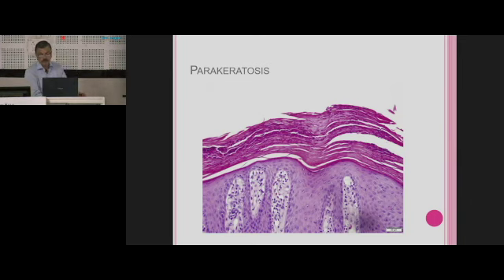The presence of a normal basket weave pattern above indicates recent onset, meaning association of parakeratosis along with orthokeratosis on top of the parakeratosis. This indicates early lesions. When parakeratosis with neutrophils is seen beneath the basket weave cornified layer, one has to look carefully for fungal hyphae.